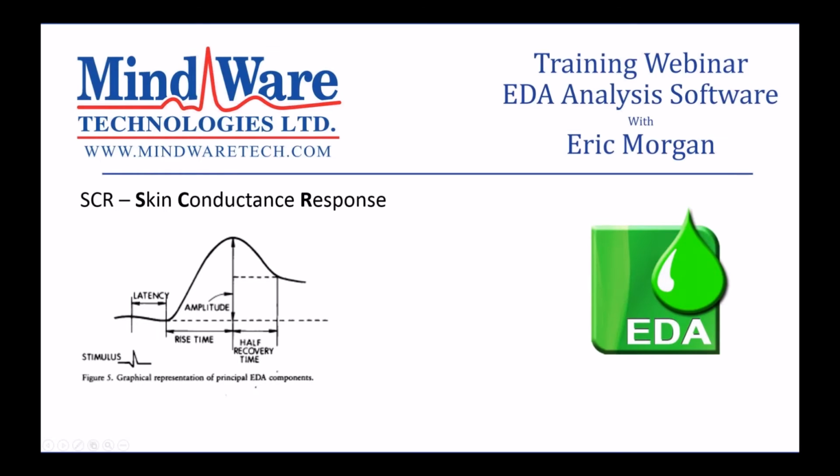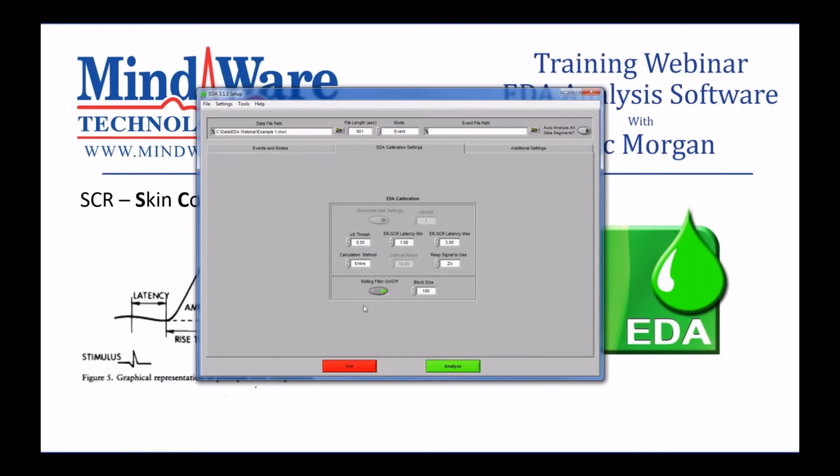And back in our application, we see this microsiemens threshold, which is that amplitude. So what amplitude change do we want to see before we consider something a skin conductance response? And generally in the literature, the default value is 0.05 microsiemens. But it is an editable parameter within the MindWare application. So you can change this to any value you'd like if you're only interested in responses that exceed a certain magnitude, for example. The next two are the latency window.